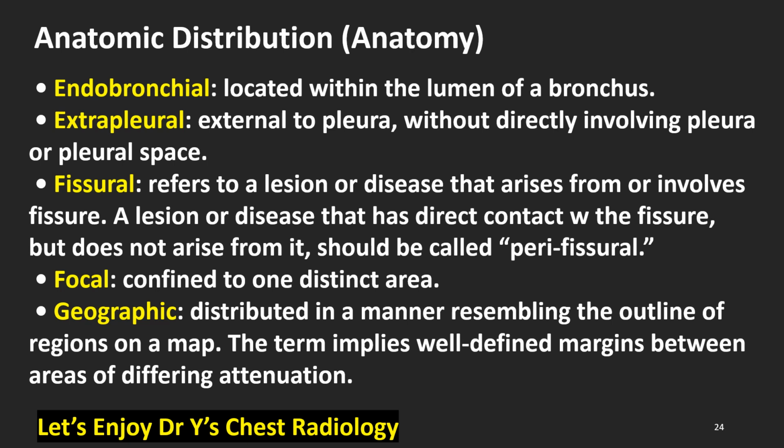Fissural, refers to a lesion or a disease that arises from or involves fissure. A lesion or disease that has direct contact with the fissure but does not arise from it should be called perifissural. Focal, confined to one distinct area. Geographic, distributed in a manner resembling the outline of regions on a map. The term implies well-defined margins between areas of differing attenuation.